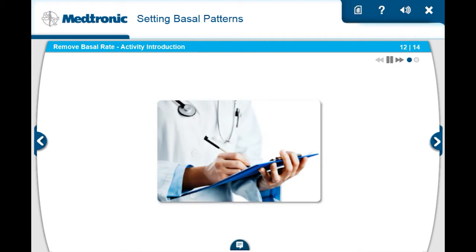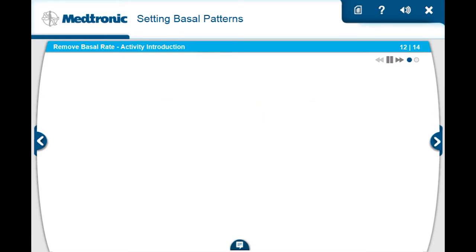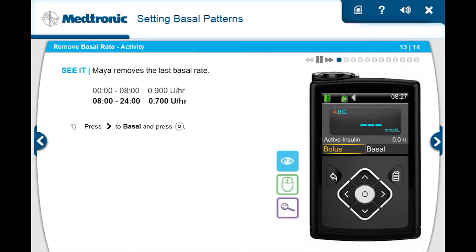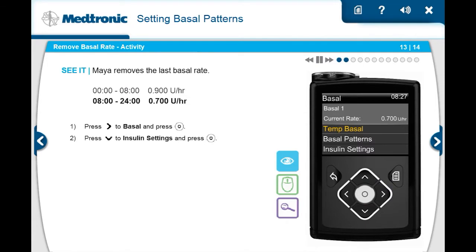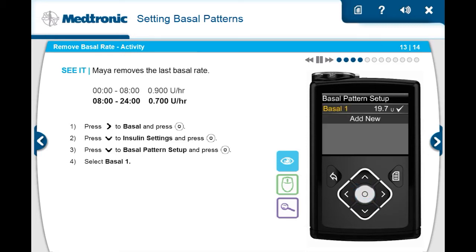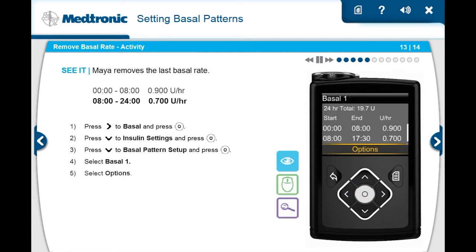After reviewing her CareLink reports, Maya's doctor decides that her 8 a.m. basal rate of 0.700 will work until 12 a.m., since her BG is a little lower than desired at bedtime. Because of this, there's no need for the last basal rate. She presses down to insulin settings and presses select. Maya then presses down to basal pattern setup and presses select. Maya selects basal 1, then selects options.